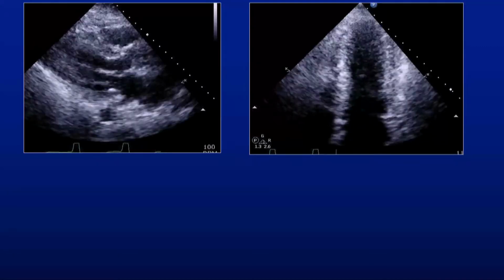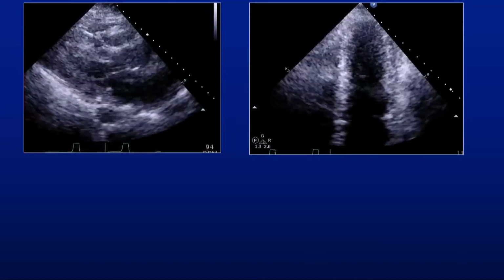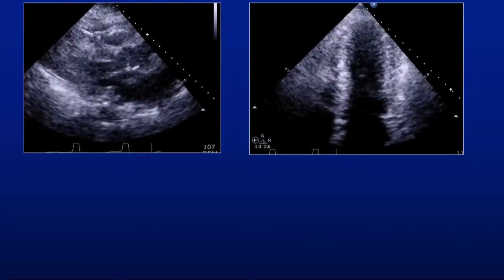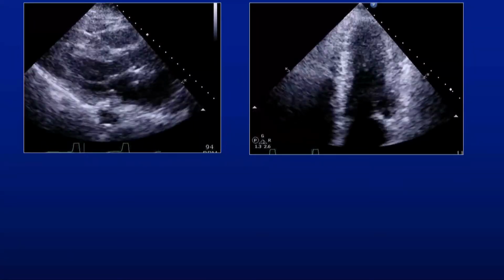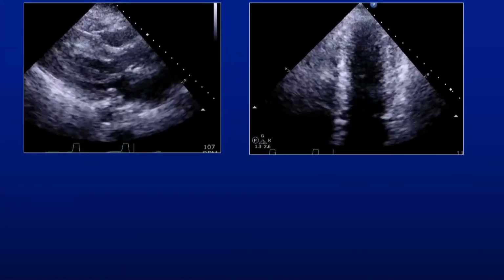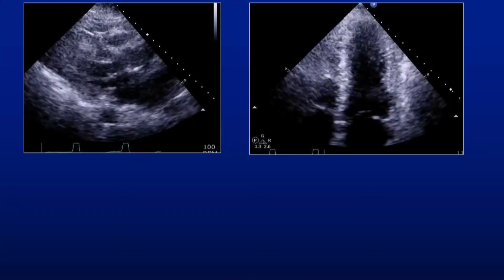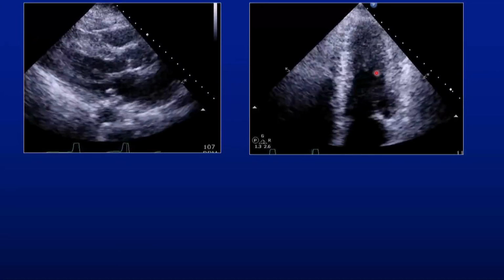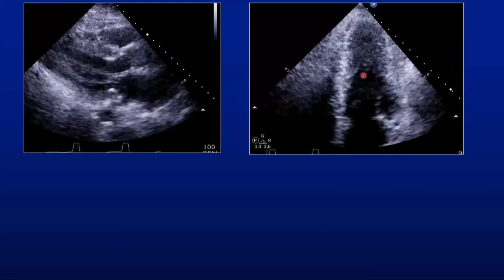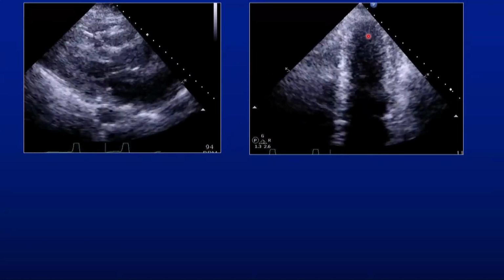If you want to describe, obviously we're not seeing well, right? And remember one thing, hypertrophy is not usually seen well from the apical window. There's a lot of dropout. This is lateral resolution, a lot of dropout. Best seen parasternally, where you're more perpendicular to some of the segments. So I have a suspicion, I agree with you, of an HCM, maybe an apical hypertrophy from mid here.